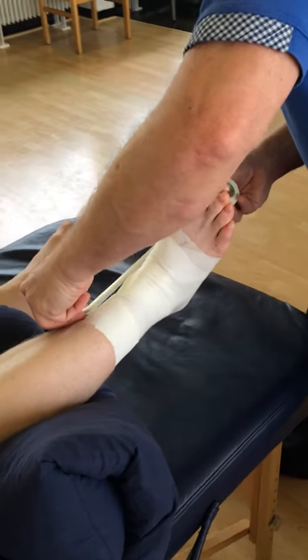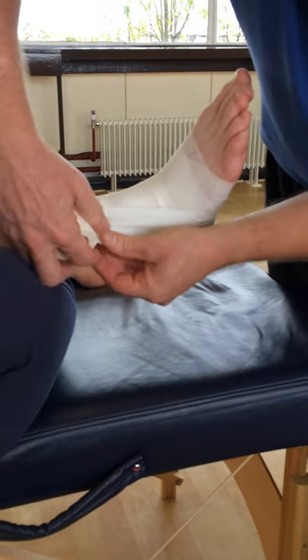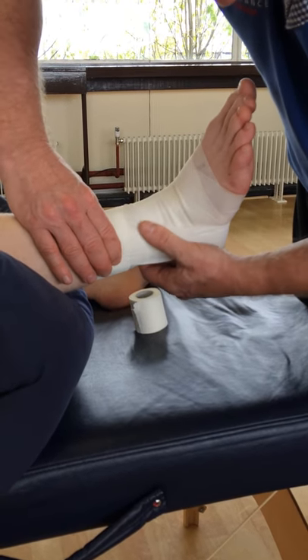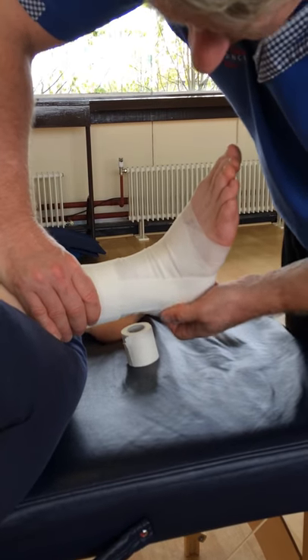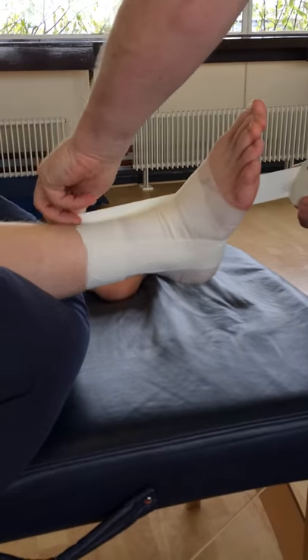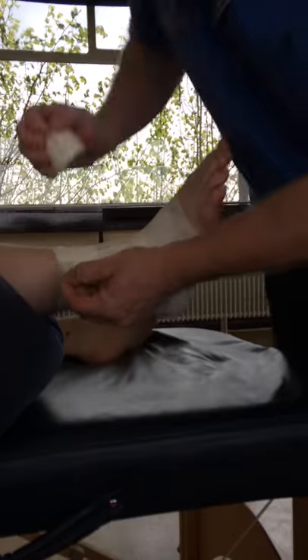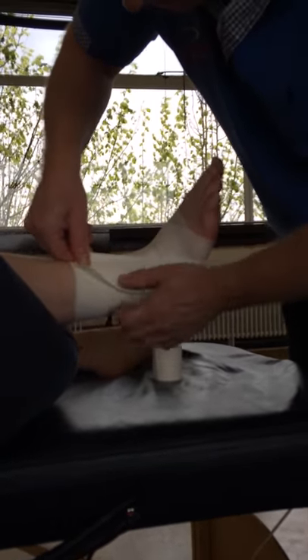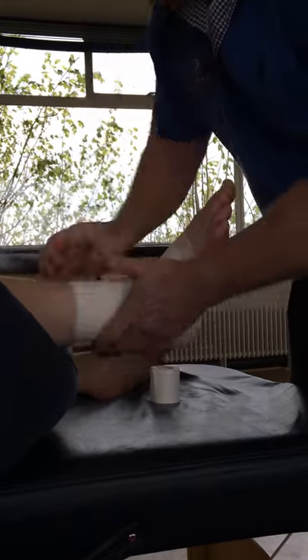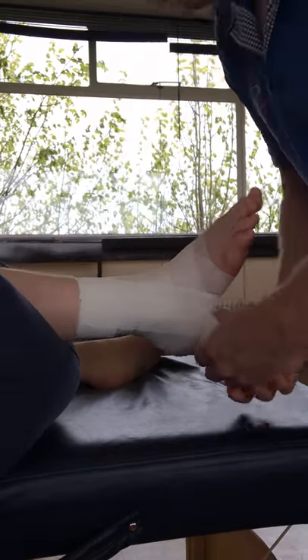We're going to go from the medial side, locking down the malleolus from the inside out. You can get latex-free tape, but you need latex-free PowerFlex and latex-free power tape for them to stick to each other. The second stirrup goes slightly anterior to cover the ATFL, moulding it down over the ligament. The third stirrup goes slightly posterior to cover the CFL — the calcaneofibular ligament.